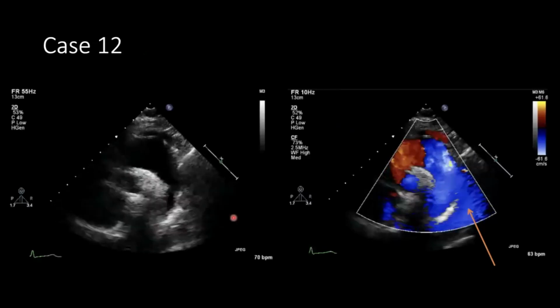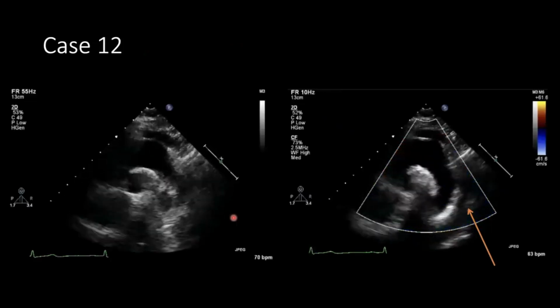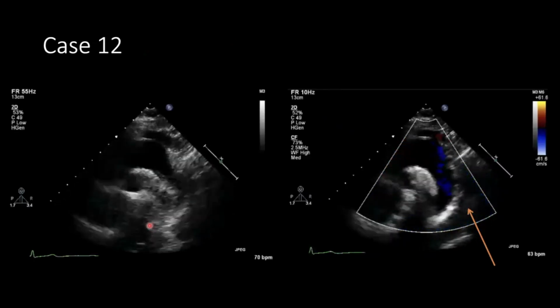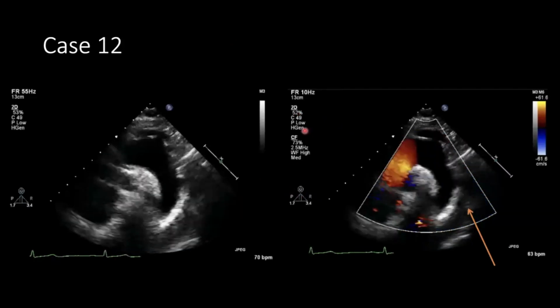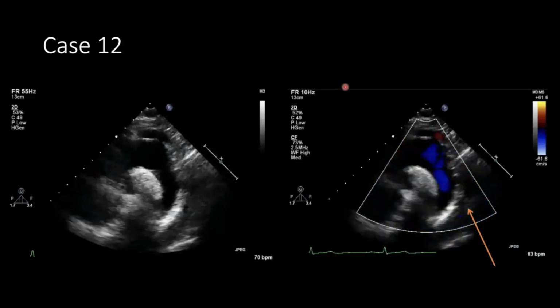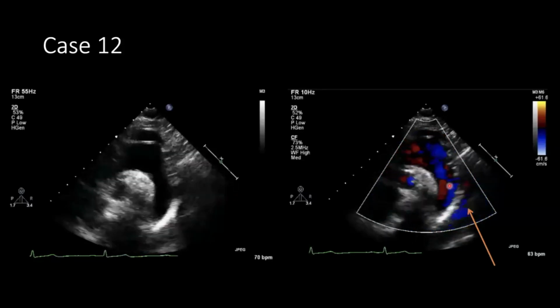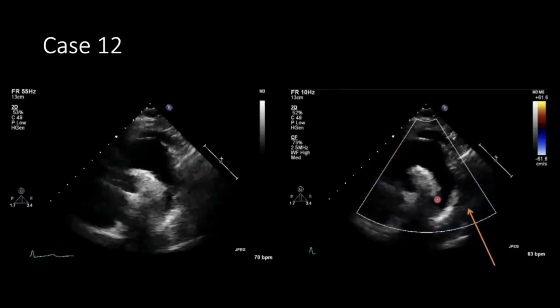We talked about this already, so I'm going to skip over this to get to another nice example. This is a good example of what we talked about earlier, a mirror artifact with color bleeding. This is a GE machine, as Veen had mentioned. Oh, this is Philips. Sorry, yes, I'm just noticing the format here. It says P right at the top there. Anyway, it occurs in both, in all machines. What this is, is color bleeding mirror artifact. It's also called blooming artifact. There are all sorts of names that people have described it by.